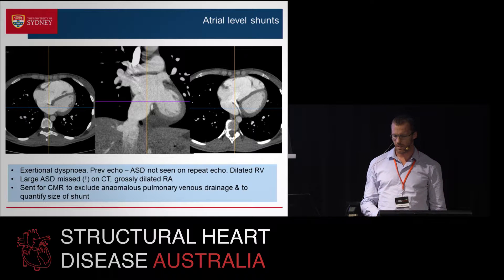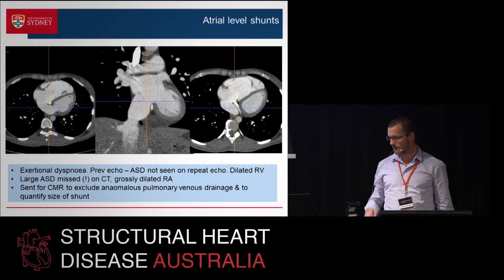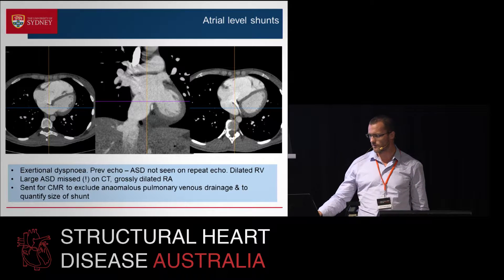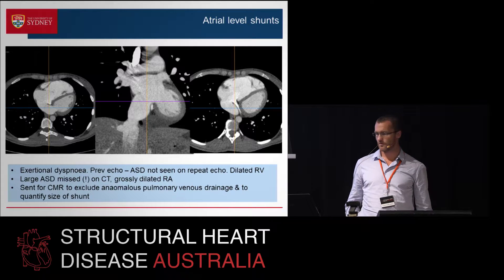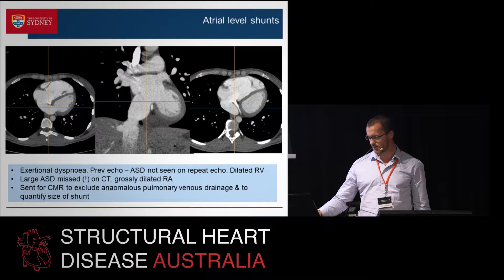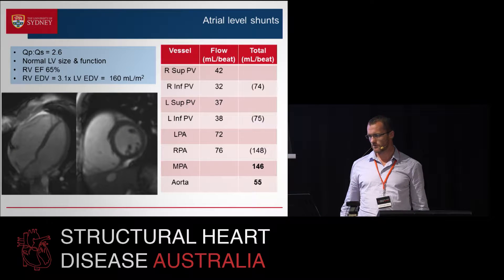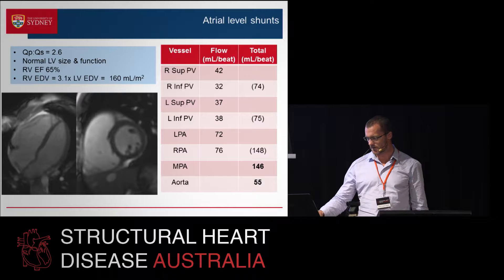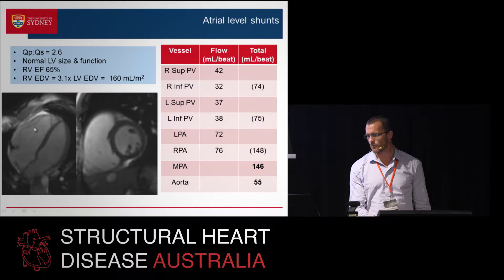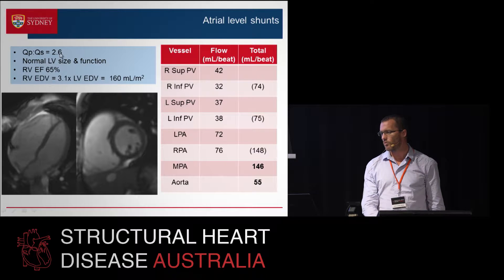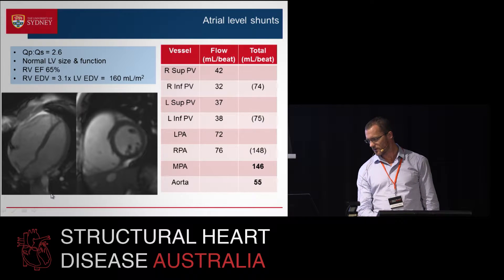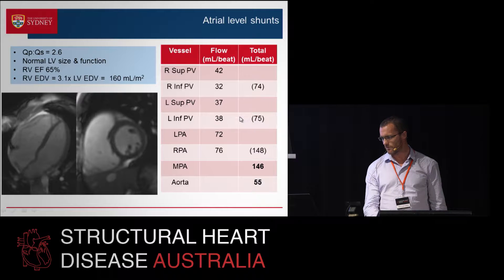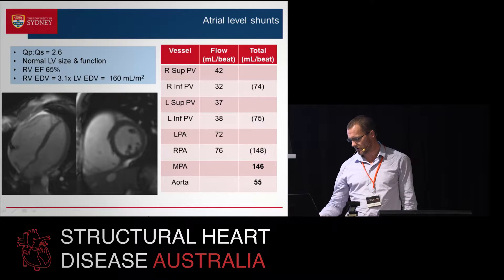This is a patient who presented with exertional dyspnea. An external echo had seen an ASD, but at the referring institution they couldn't find it. They had a CT which was reported as normal, which it wasn't — there's clearly an ASD, probably an inferior sinus venosus type. They were sent to us to quantify the shunt. We reviewed the CT afterwards and saw it, but we also saw it with MR. You can see a hugely dilated right ventricle — about three times the left side — normal function and a QP:QS of 2.6. Our flow audit showed massive flow through the pulmonary vessels indicative of shunt and no evidence of anomalous drainage.